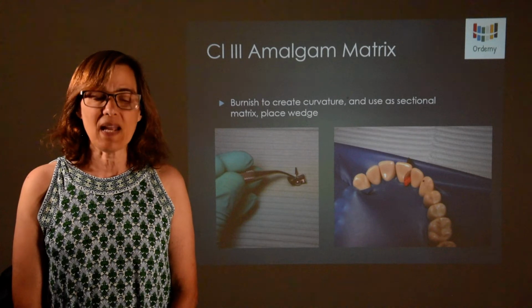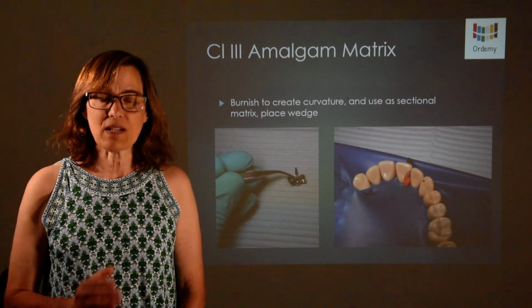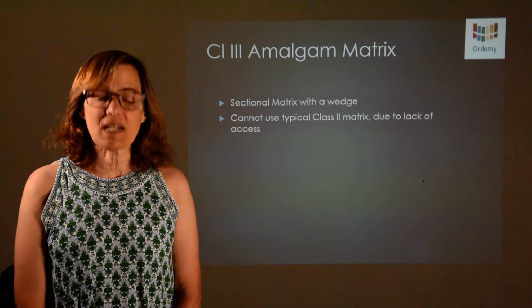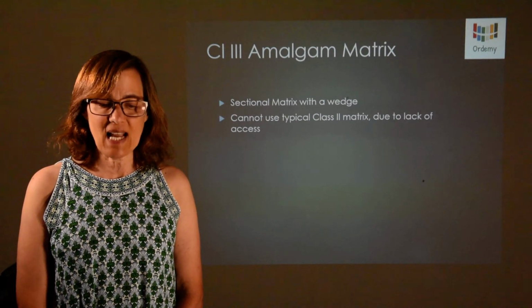The matrix system consists of the matrix band and the wedge. The Class 3 amalgam matrix consists of a matrix band and a wedge.